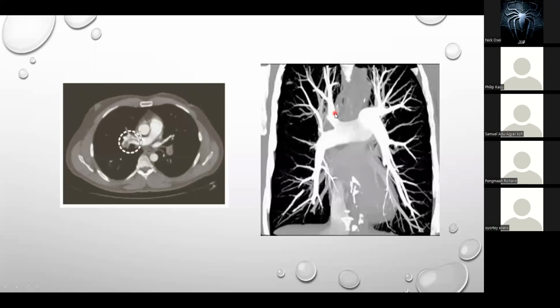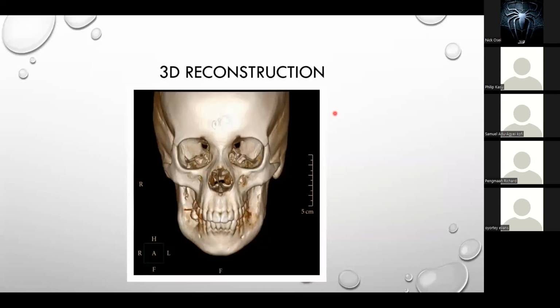All right. So this is also a CT scan. Typically, when we have head injuries where there are skull fractures and the rest, when you ask for 3D reconstruction of the skull, you get a good image like this.